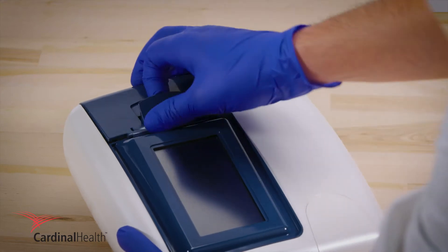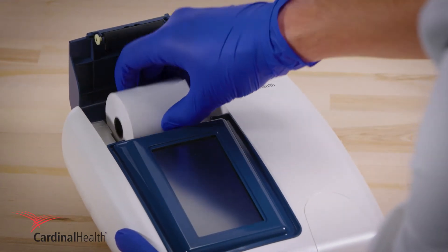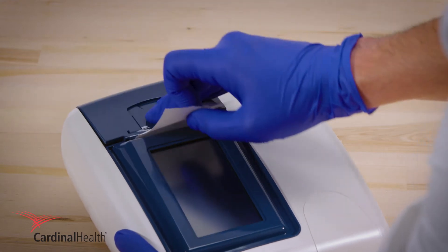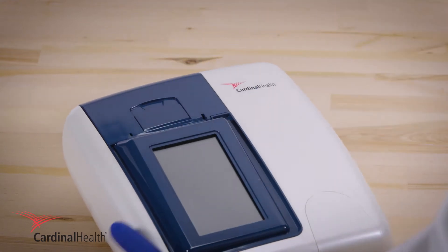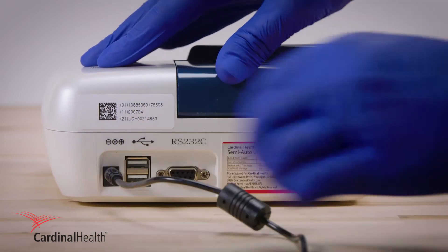Set up your new analyzer by installing the paper roll with the edge facing up. To ensure your device is in working order, plug it in and press the power button.